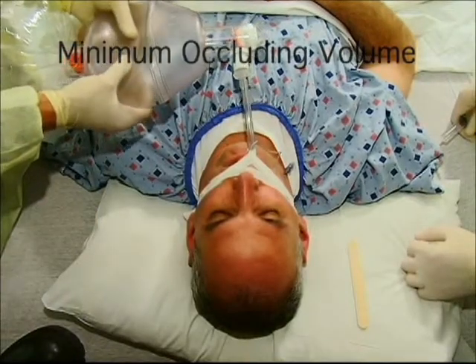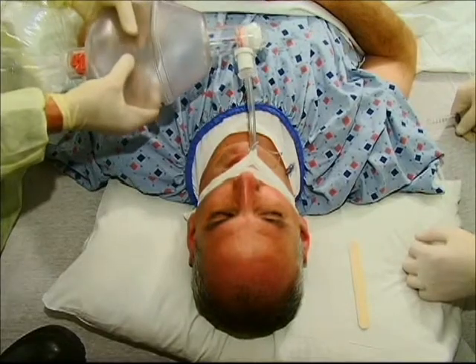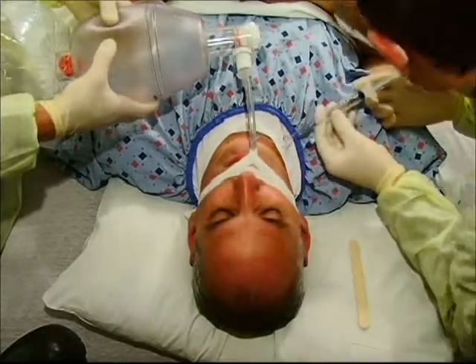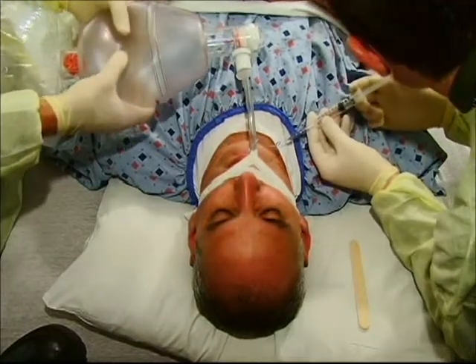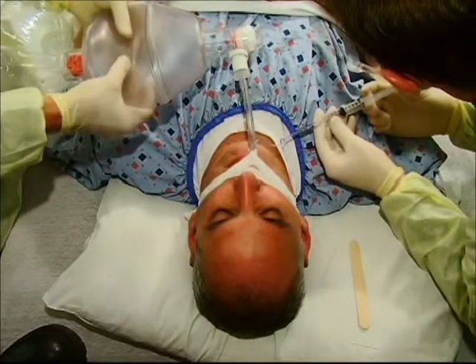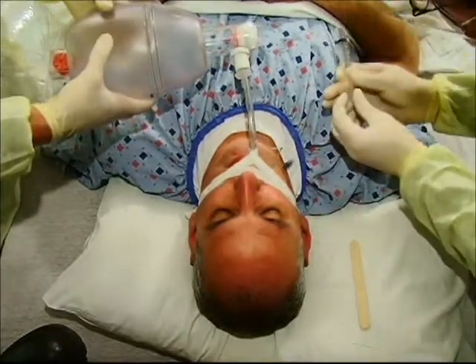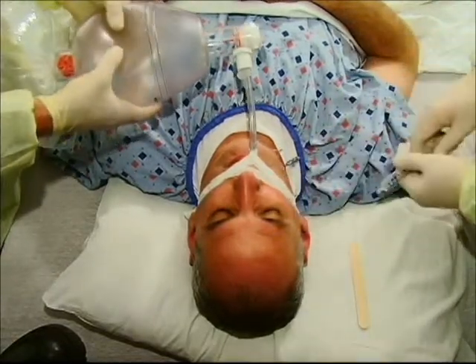Minimum occluding volume. This procedure may be practiced on an intubated mannequin. With another person providing manual ventilation, inflate the cuff slowly using a clean, dry, 10 cc syringe to inject air into the pilot balloon. Begin by injecting 1 cc of air and listening for air leaks during peak inspiration. Continue injecting air in one-half to 1 cc increments while your partner continues to administer maximum inflation breaths with manual ventilation. Stop injecting air when a leak is no longer heard over the neck or through the mouth. Document the total amount of air injected that was required to obtain a good seal during peak inspiration.